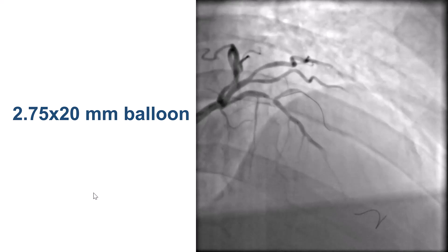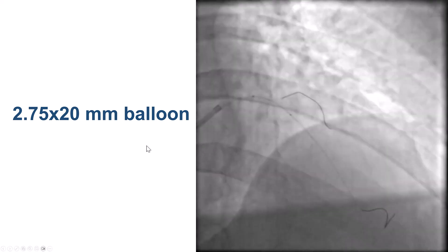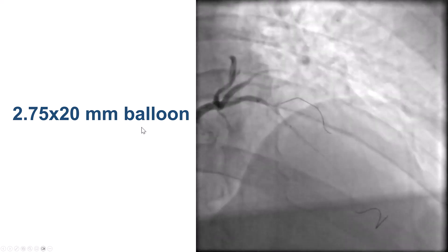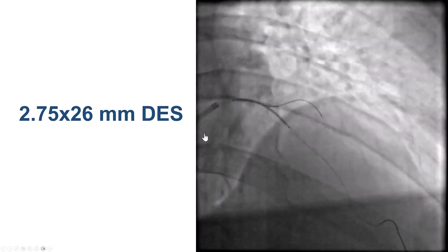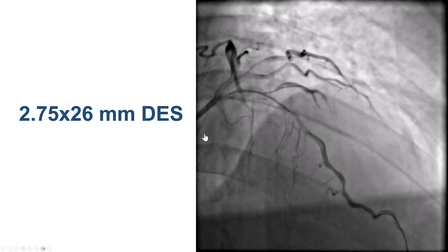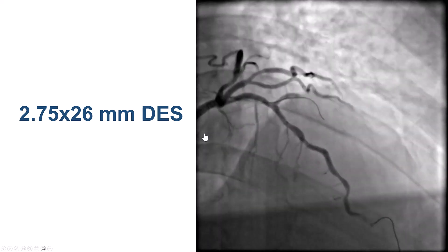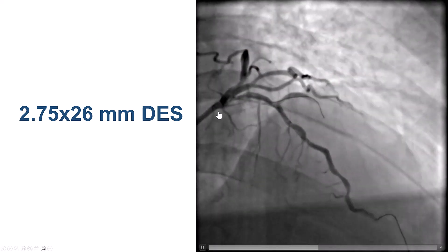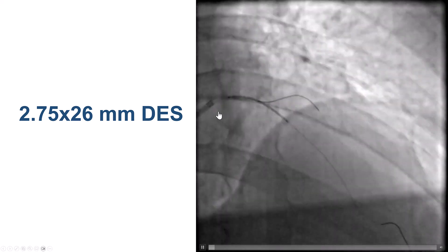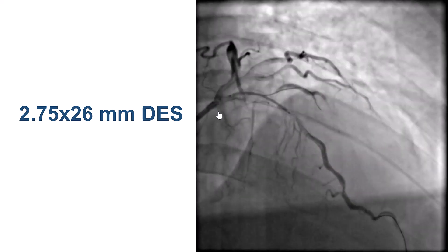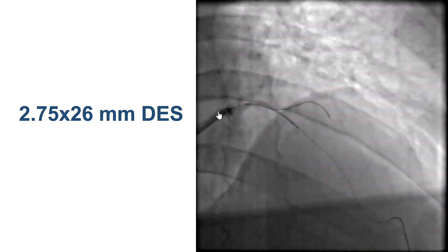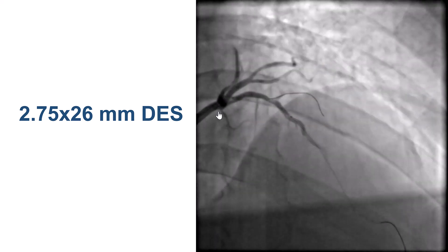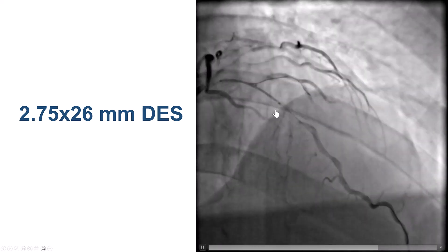We pre-dilated with a 2.75 millimeter balloon, and we should have been more concerned about the sluggish flow into the diagonal branch. We thought the flow might improve if we stented the main vessel, because we thought there might be some dissection proximal to the diagonal takeoff, so we placed a 2.75 by 26 millimeter DES. This was based on both CT and IVUS imaging. On CT we measured about 2.5 distal reference, so we upsized to 2.75.